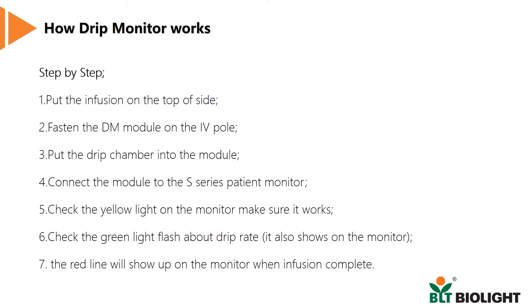First, fasten the DM module on the IV pole. Then put the drip chamber into the module. Connect the module to an S or P-series patient monitor. You'll see a yellow light turn on and the DM parameters will appear on the monitor. You may adjust the drip rate using the roller clamp. The green light will flash at the same rate as the drip, and simultaneously the patient monitor shows the corresponding drip rate. After the infusion is complete, the drip monitor module automatically clamps the IV tubing and the blinking light turns yellow.